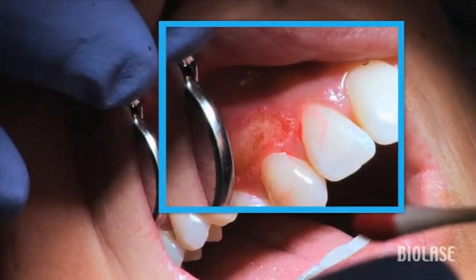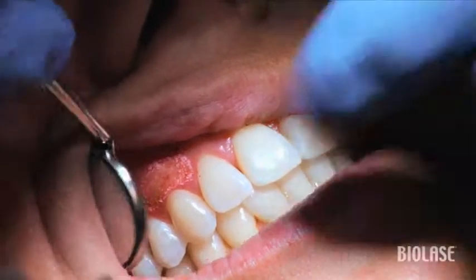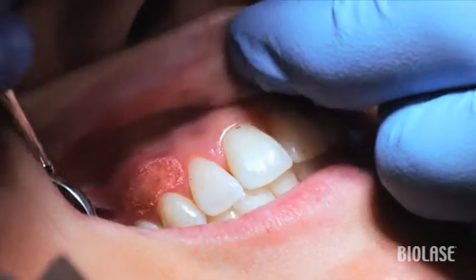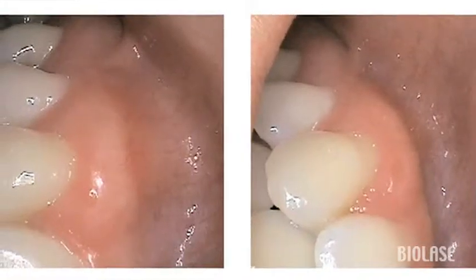Even if the patient has no post-op bleeding, follow up the removal of the excess tissue with the hemostasis preset for about one minute, as presented in the fibroma removal video. The intraoral pics taken one week post-op show the beautiful healing. The patient was very happy with the result and was amazed that we can do this so easily and painlessly.